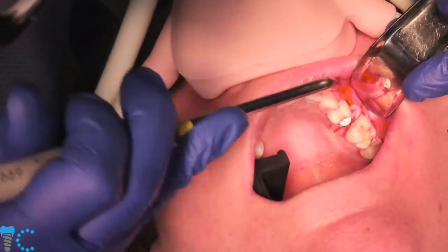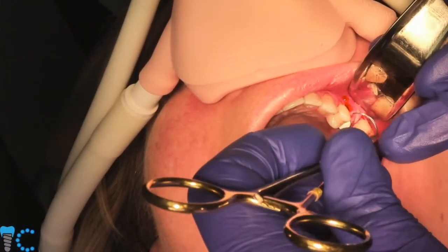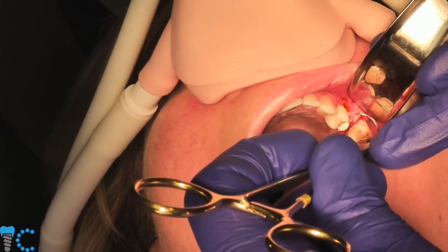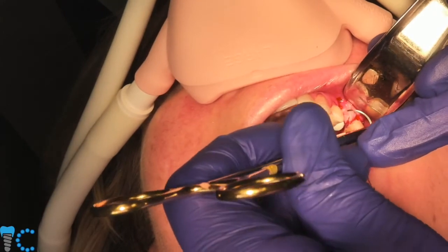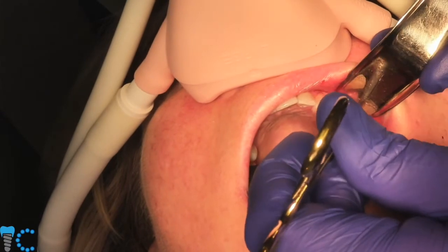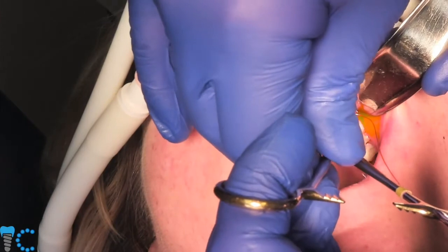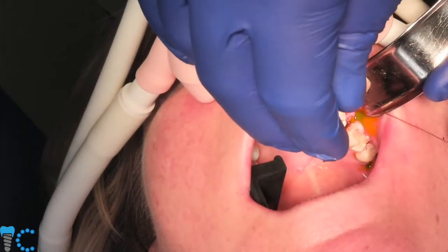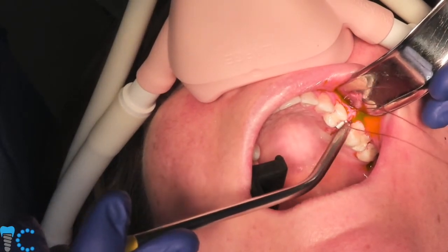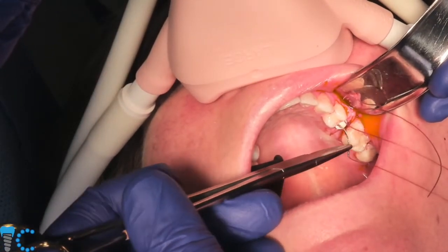Now, when it comes to, let's say, implant infections, do you notice a comparison of this compared to titanium, like a major difference there at a rate? Our success rate for these has been very similar to our success rate for titanium implants. Infections are a pretty rare reason why an implant fails if you're treatment planning them properly. But we'll find the main thing is just that they fail to osseointegrate for both titanium and ceramic.